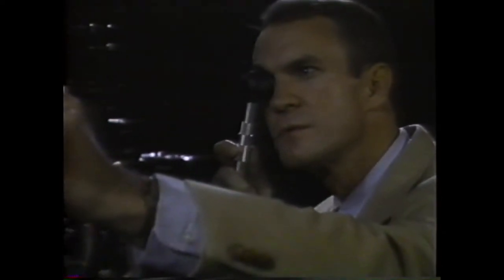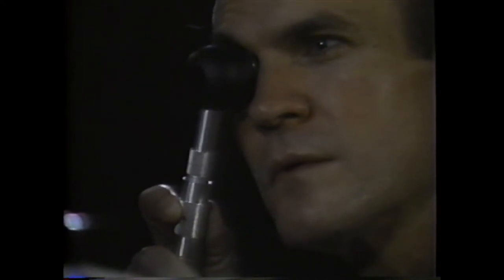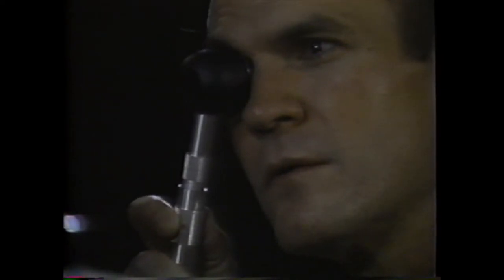Here is the only place that you should ever lower the sleeve in the neutralization technique. If there is more than one diopter or so of astigmatism, you can enhance the reflex, making it narrower and brighter by adjusting the sleeve downward. Notice that both the intercept and the reflex become narrower and brighter as we seek the position of the sleeve giving the best enhancement. Enhancing the reflex serves only to help locate the cylinder axis with better precision, and you should never attempt to neutralize the reflex when it is enhanced. If the reflex will not enhance, return the sleeve to the extreme up position.